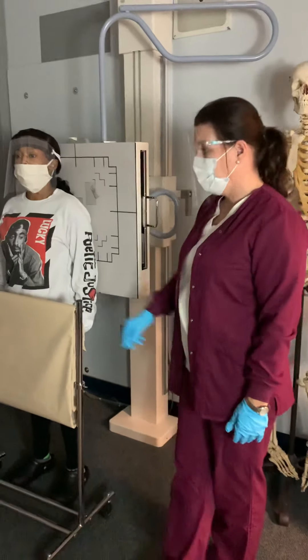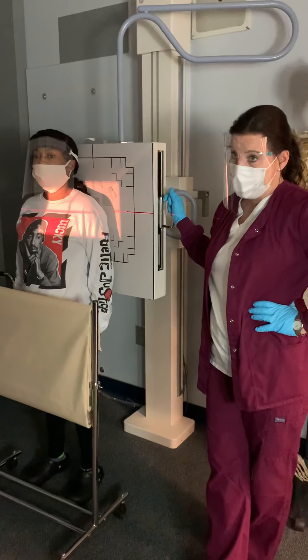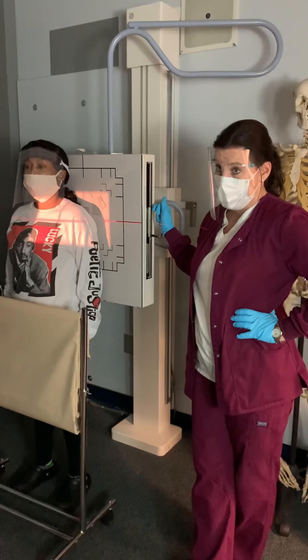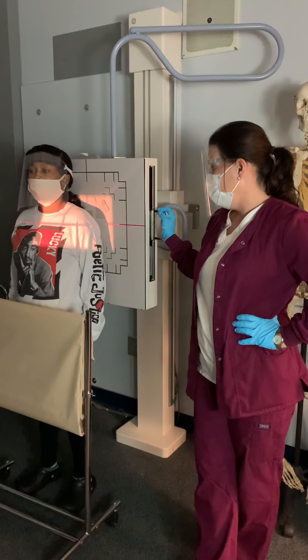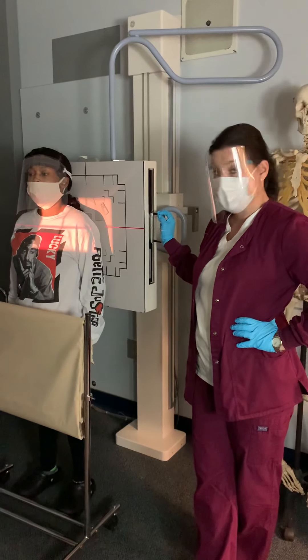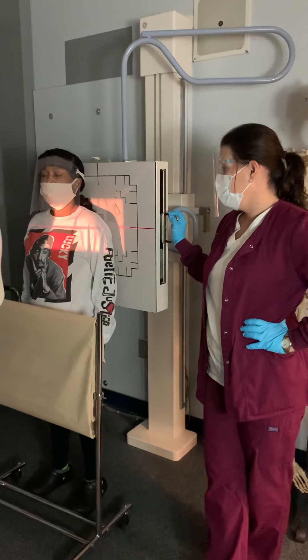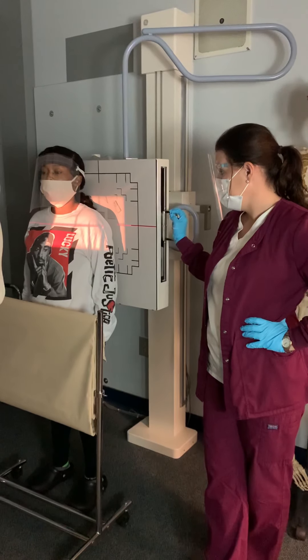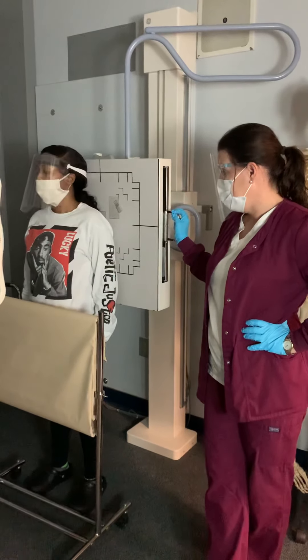Next, we're going to go into the Grashey, which is an oblique. Backing up — technique for APs and Grashey: 85 KVP using the center chamber. If you're doing a manual technique where you have to set your mAs, maybe you're not using the wall bucky, it would be 85 KVP and about 4.5 mAs. That's for the APs and the Grashey, and it's in your technique chart.